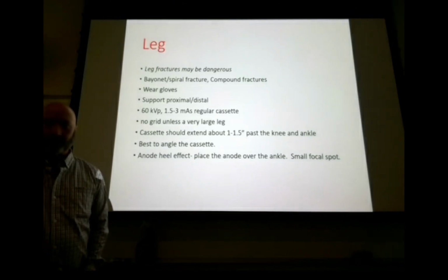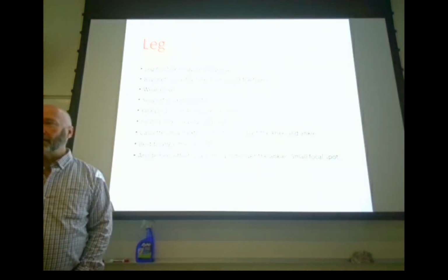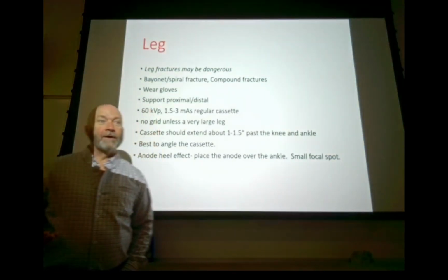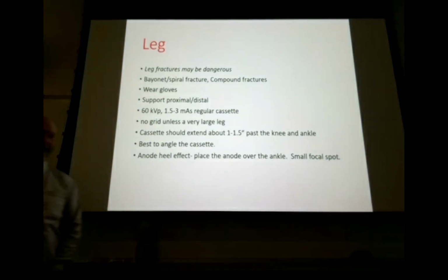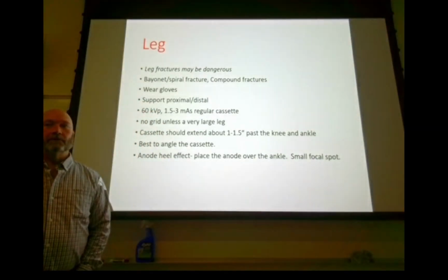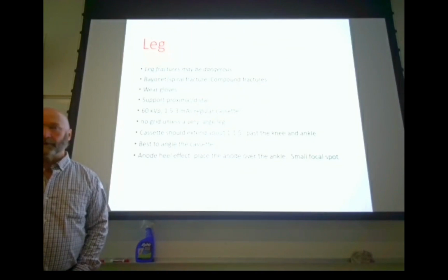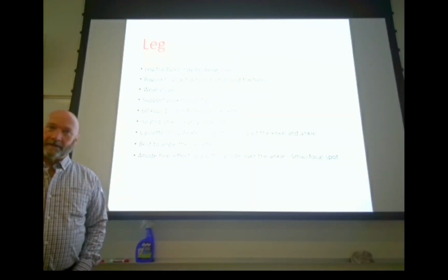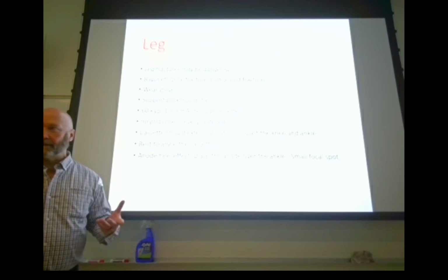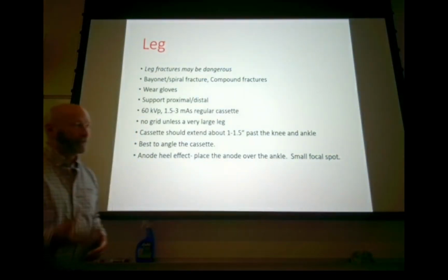So now I'm questioning the patient, what's going on? Turns out she was diabetic, and she had neuropathy in her foot, so she couldn't really feel. One of two things is going on with neuropathy. Oh, you're going to go throw up, huh? No. Either they can't feel anything, or they're always in pain, right? So she walked down to the X-ray department with this open sore on the bottom of her foot. If we'd gotten her down there in a wheelchair or on a stretcher, and without gloves on started manipulating her foot, we'd come back with nastiness, right? So put your gloves on for feet.